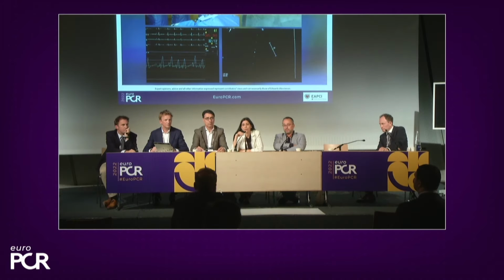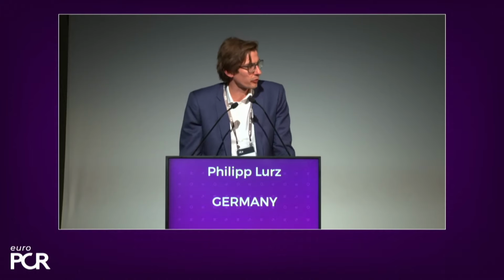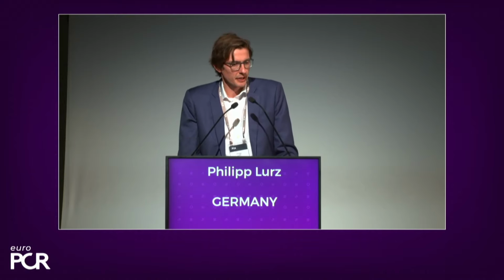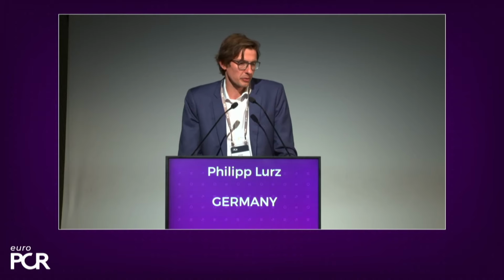We have some time for comments or questions from the audience. If you have any, don't hesitate. I've noticed that you do all your grasping with a breath hold. Yes. Systematically. Almost always, unless it's really pretty straightforward. But in anything more complex, we like to do breath holds because obviously it gives you more stability, less motion. Normally, during ventilation, the device is moving from medial to lateral, and by having a breathing stop, you get rid of that motion, and the procedure is much easier, and you can be more precise with your steering and with the implantation.